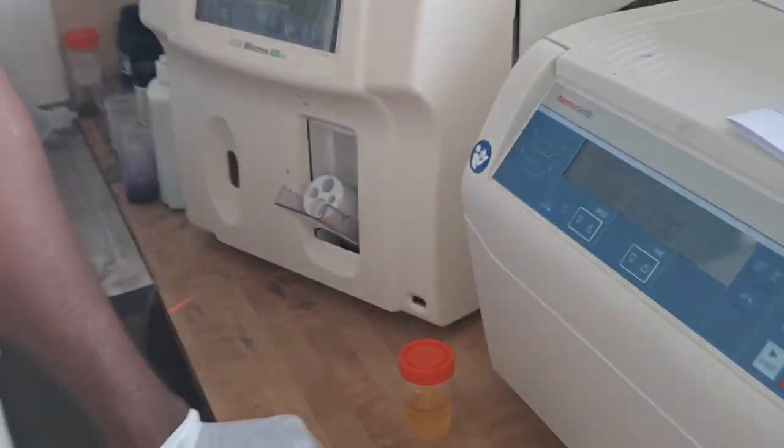Now, is anybody free to ask questions concerning this procedure? For some of us, it will be the first time doing it. We've never seen it and we've never done it before. Can anyone who has more questions ask anything? Definitely.